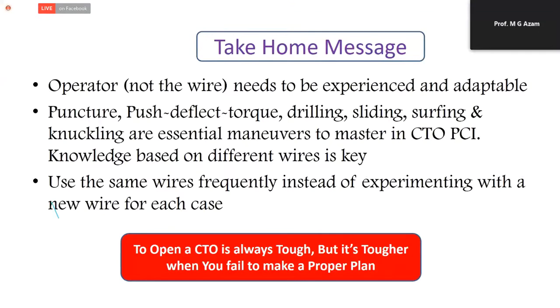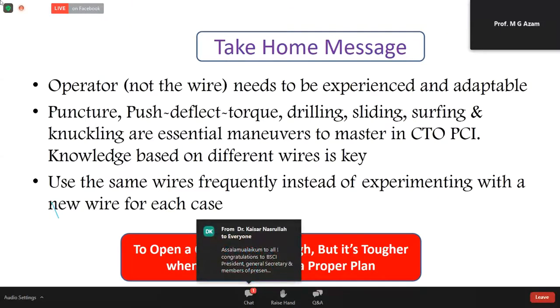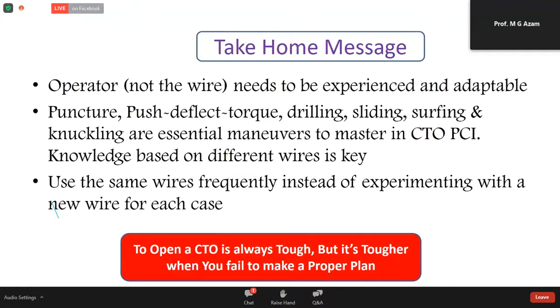Knuckling is a good technique, especially for safety reasons, but we should remember that we should not use it with wires other than Fielder and Pilot, because you can do everything by knuckling. It is a game, I must appreciate, but a very dangerous game. If you consider Gaia or Conquest Pro or Confianza, that will make a catastrophe. So we should remember that all the literature so far only permits knuckling with Fielder and Pilot.